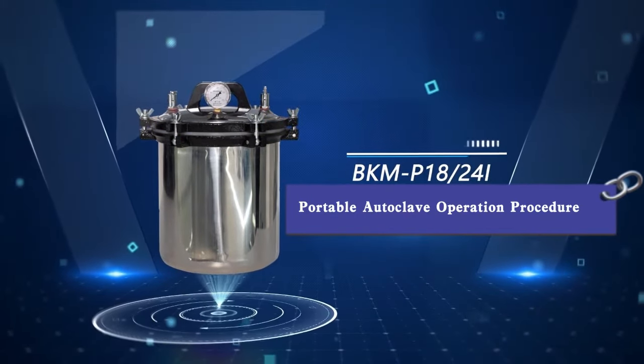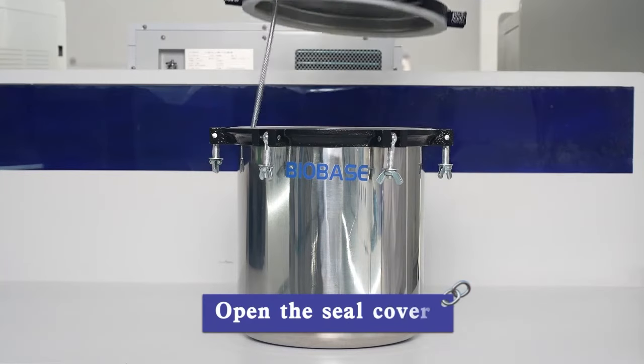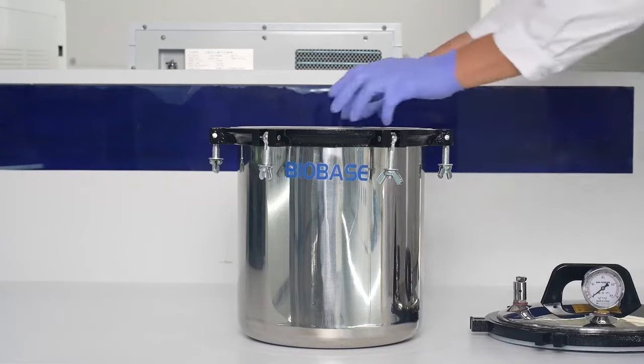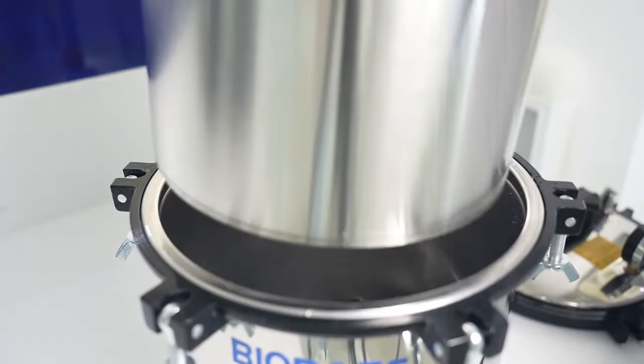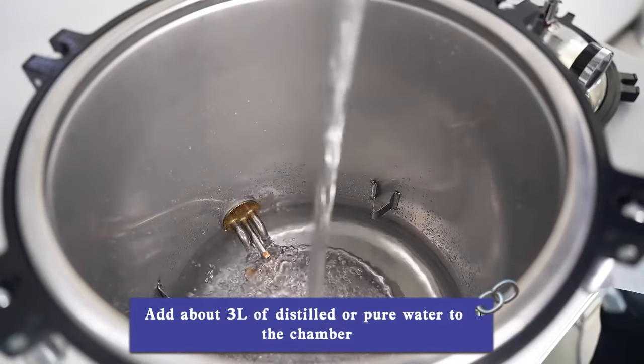Portable autoclave operation procedure. Open the seal cover. Take out the disinfection bucket. Add about 3 liters of distilled or pure water to the chamber.